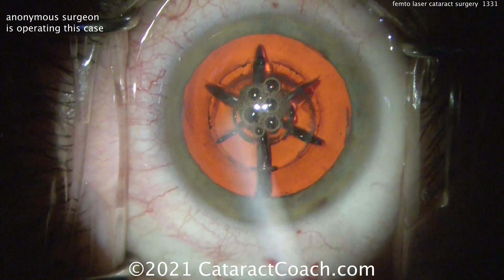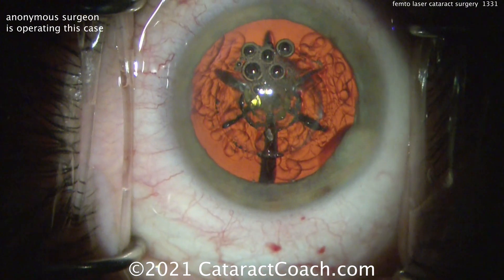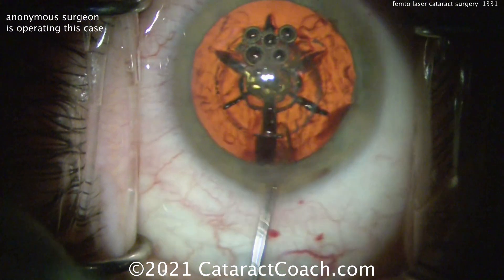So in this case it's submitted by an anonymous surgeon, but I thought it would be fun to watch together. That first incision was the paracentesis. Now filling up the eye with some viscoelastic. And now the main incision is being opened up.